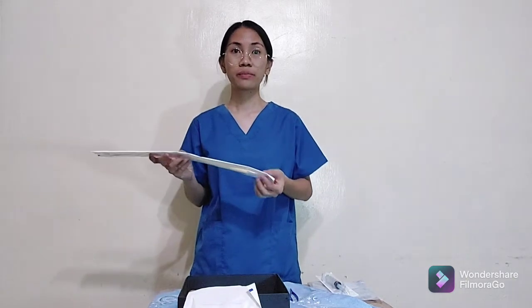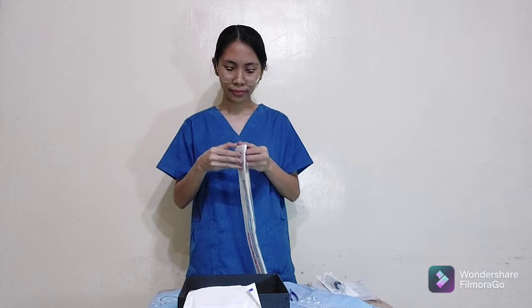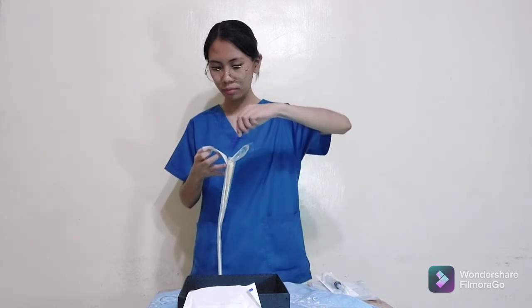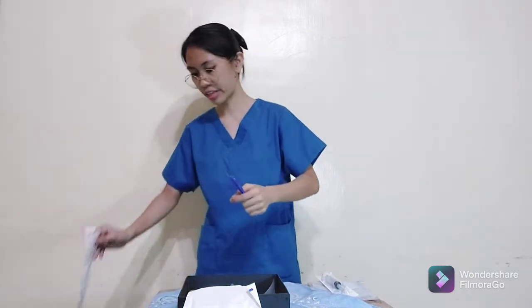And now I'm going to check the size and type of the catheter. Use the smallest size of catheter possible, because a large catheter size increases the risk of urethral trauma. So I am going to use a 2-way Foley catheter with a size of 12 French. And now I put the Foley catheter into the catheterization kit. So let me discard this.